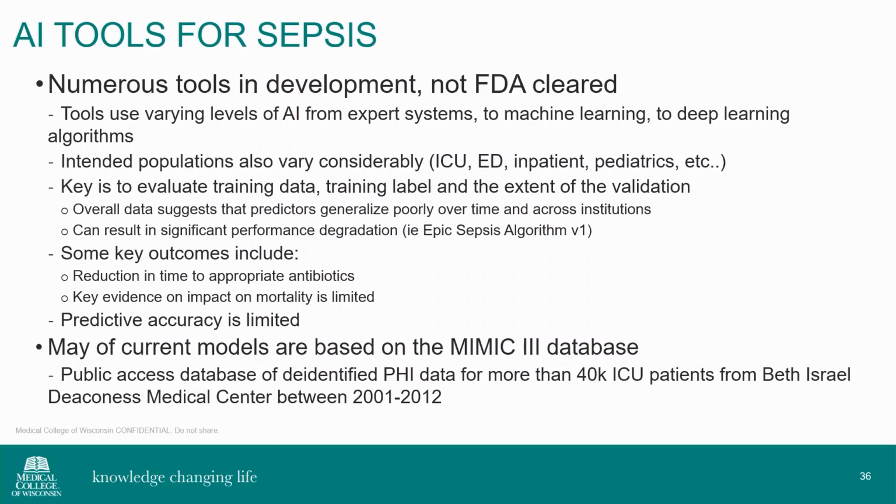It's also important to note, just because somebody says, I'm using AI for the diagnosis of sepsis, not all AI is created equal. These tools use varying levels of AI, ranging from expert systems, so think your Vitek, that helps you interpret your susceptibility, so if, then this types of rules.